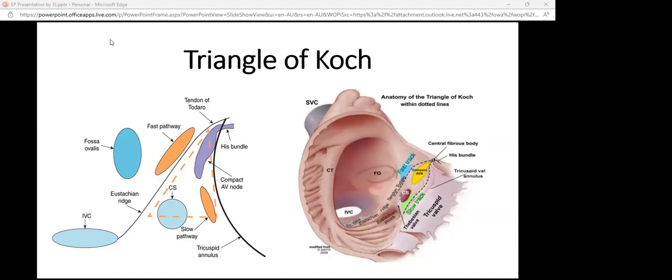It actually could just be a pathway then, not nodal. Yeah, exactly. I'm not doing it to say is it pathway or is it nodal, I'm more just saying is there conduction. I'd be brave enough to say there's VA conduction, but I wouldn't be brave enough to say it was via a pathway. Okay, interesting. I just wasn't sure if it was always going to be a pathway, but it's 6 to 1 after. Okay, perfect.